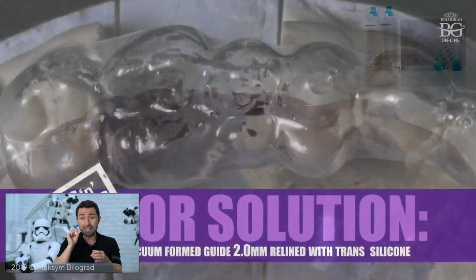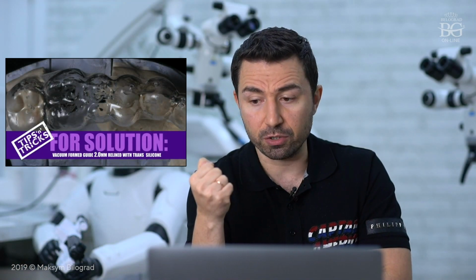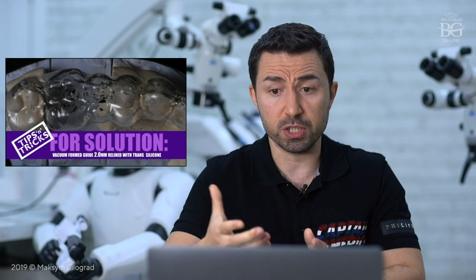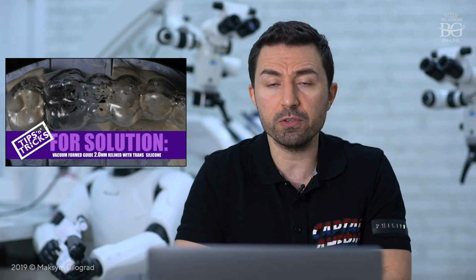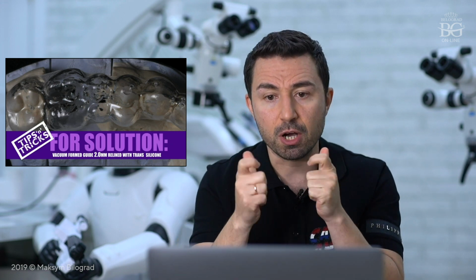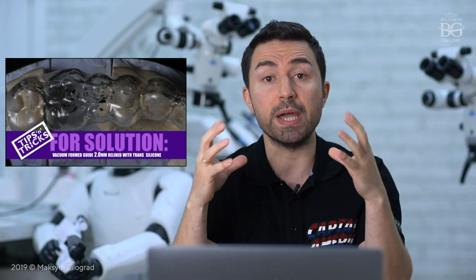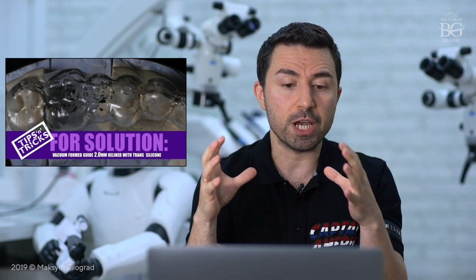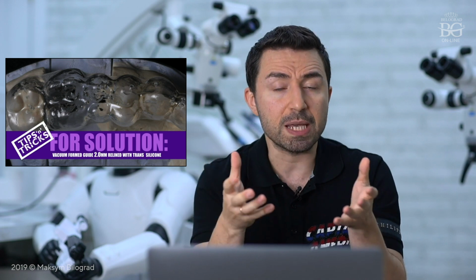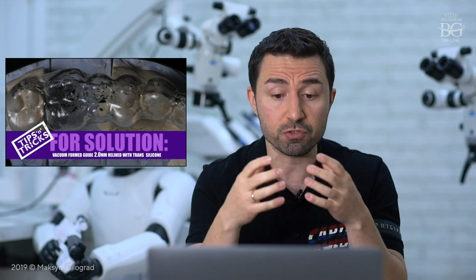One tip: if you just take an impression with transparent silicone index, it will be pretty soft, and if you press and manipulate this transparent silicone index in the patient's mouth, you may get distortion because the material is pretty soft. The trick is to make a rigid base. The rigid base can be created using thermoplastic material, the same material that we use for night guards or for bleaching trays.